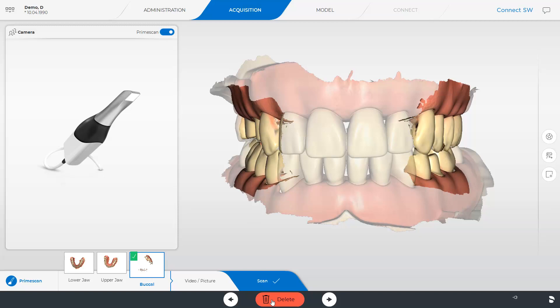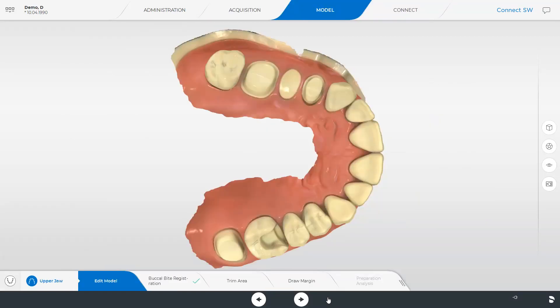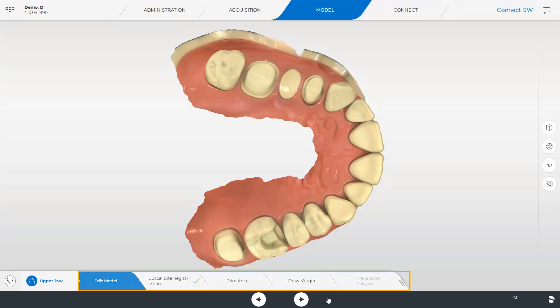Once a green check mark is displayed in the buccal image catalog, we can switch to the next phase, the model phase. Now, we could already send the case through the ConnectCase Center portal to our partnering lab. Alternatively, we can proceed with the steps in the Step menu.